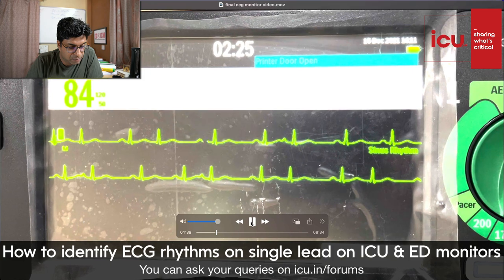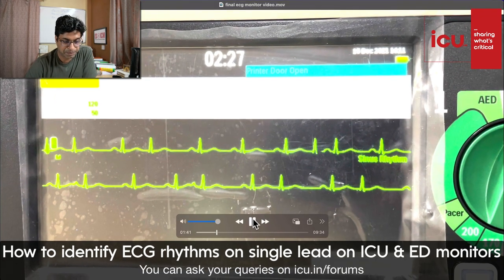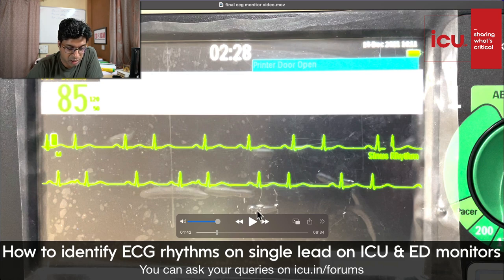Okay, now you see here. This is a normal sinus beat because the P wave is followed by a QRS complex, a narrow complex. But there is no P wave there, but there is a narrow QRS complex. Here there was a P wave which was different from the sinus P wave, meaning the P wave was generated from somewhere in the atria, so we call it PAC, premature atrial complex or contraction. But here there is no P wave, so it has originated from somewhere around the AV node, at the junction. So it's a junctional premature complex. You got my point? It has originated from somewhere around the AV node, because the P wave is not there. Okay. Again, there is no P wave, premature junctional complex.